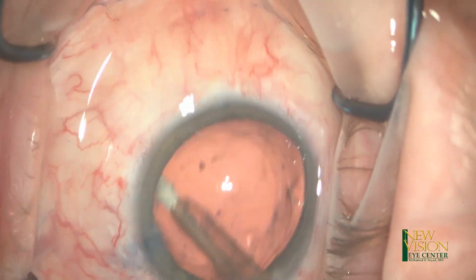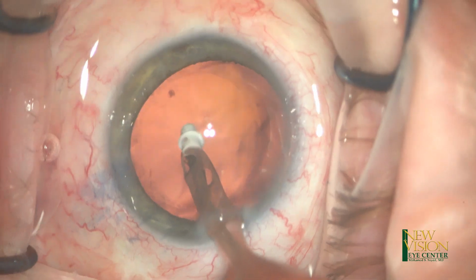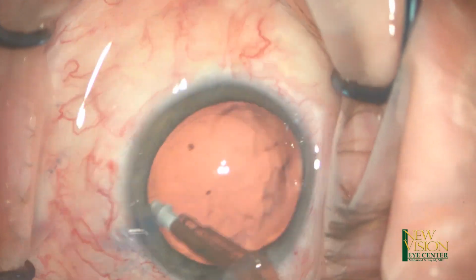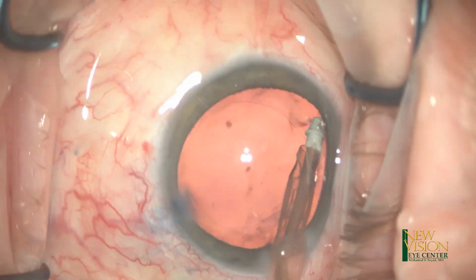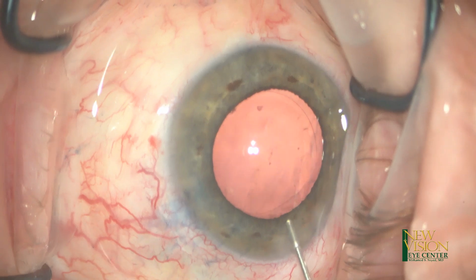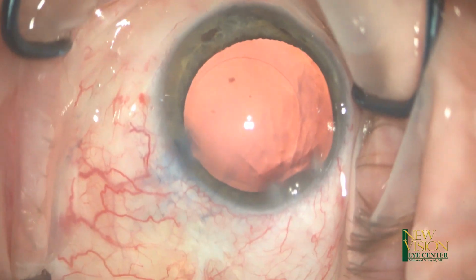I then polish the posterior capsule as well as the undersurface of the anterior capsule, the rhexis edge. I make sure that I get as many of these small opacities as I can. I then inject some viscoelastic to fill the bag before I inject the lens.